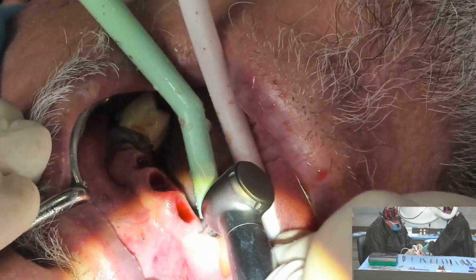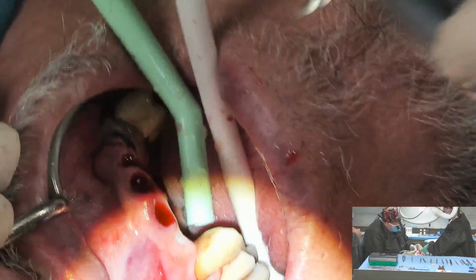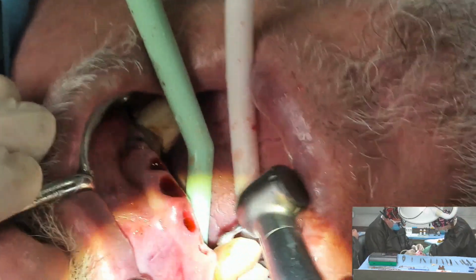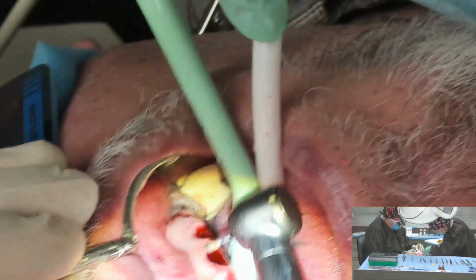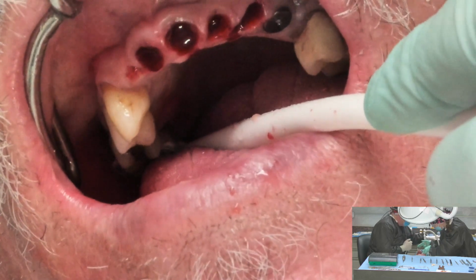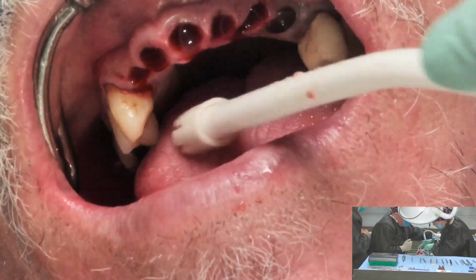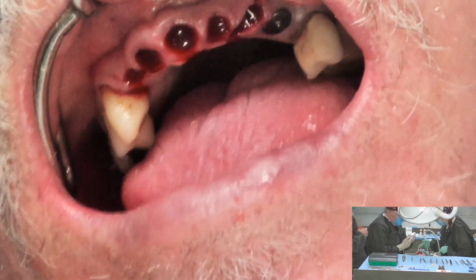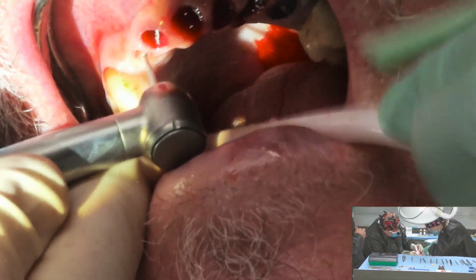And I wrote this paper back in 2005, which we call a sculpted implant receptacle site, because I know the parameters of this socket. I want to make this socket respond as I know this will and this will, but we're also setting up our emergence profiles at this point around the area. And I think something like this is critical to the success of the case, aesthetically, biologically. I'm going to need a little larger round burr, long shank larger round burr.